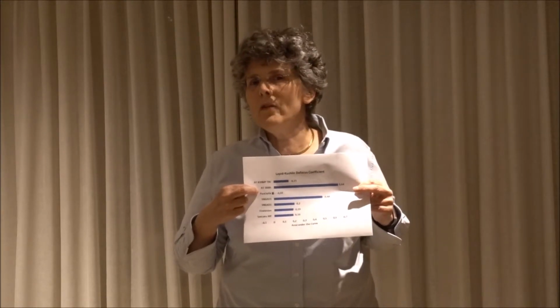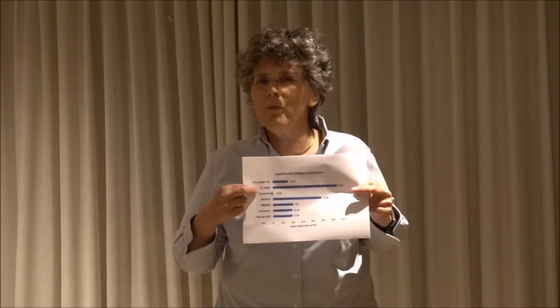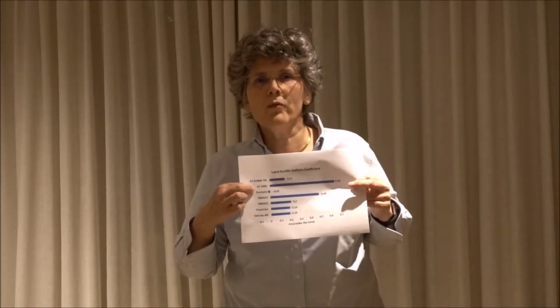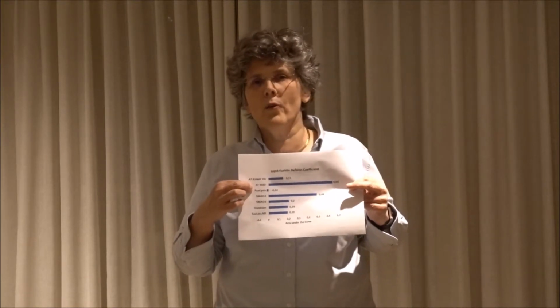Why does this lens have a negative defocus coefficient? Because we're using logMAR, and the smaller the logMAR is, or the smaller or lower the Lapid-Kushlin defocus coefficient is, the better defocus functionality we have of these multifocal IOLs.